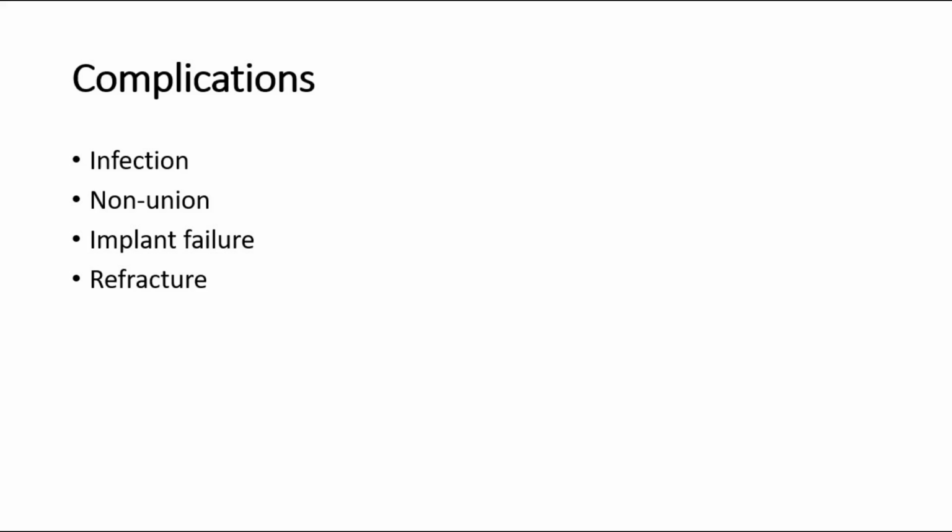Lastly, refracture. It is important not to remove metal implants too soon, or the bone may refracture. A year is the minimum, and 18 or 24 months is safer.